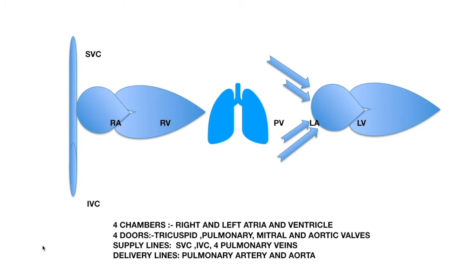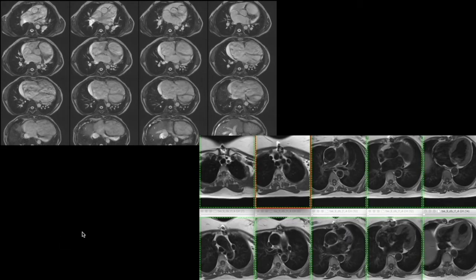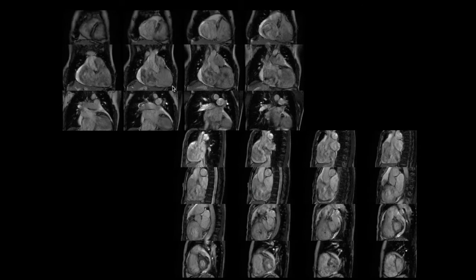We will start by imaging the thorax from the apex down to the diaphragm, and may extend below up to the renal level, so that we cover the complete thorax as well as the upper abdomen. This gives us an idea about the visceral position as well as the heart position. Once we get these images, we will then go to coronal and sagittal planes to see where the cardiac axis is directing.